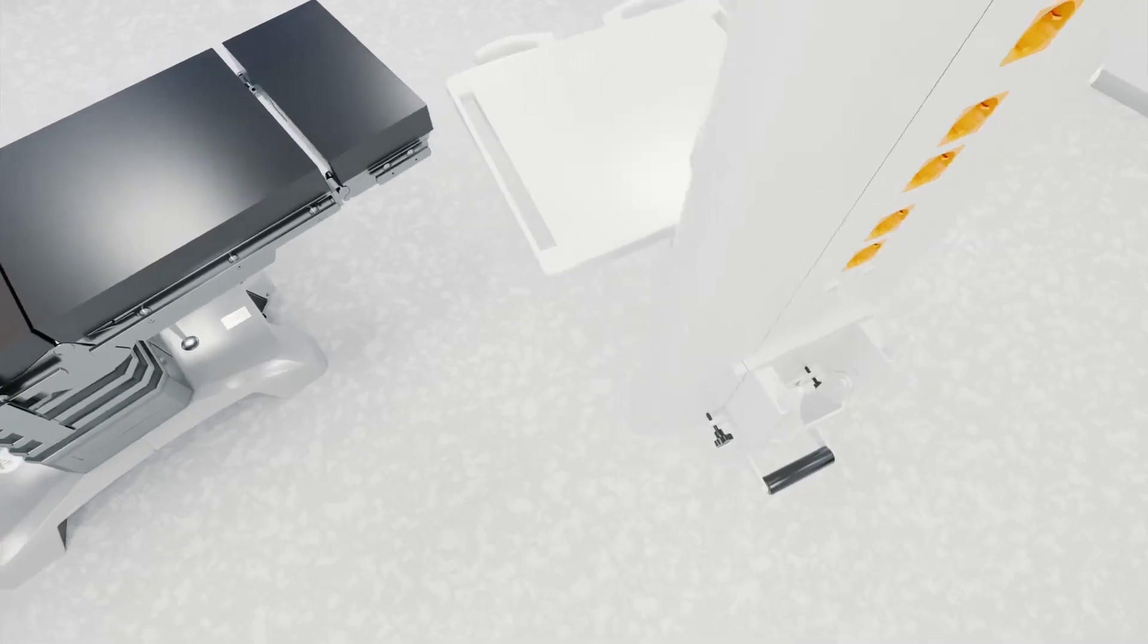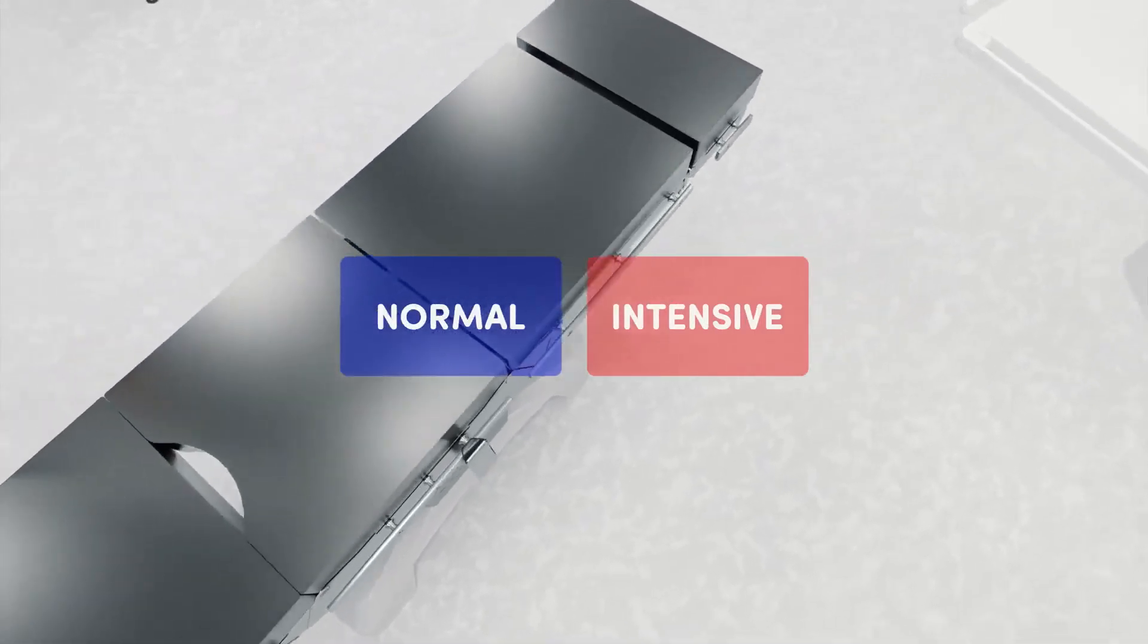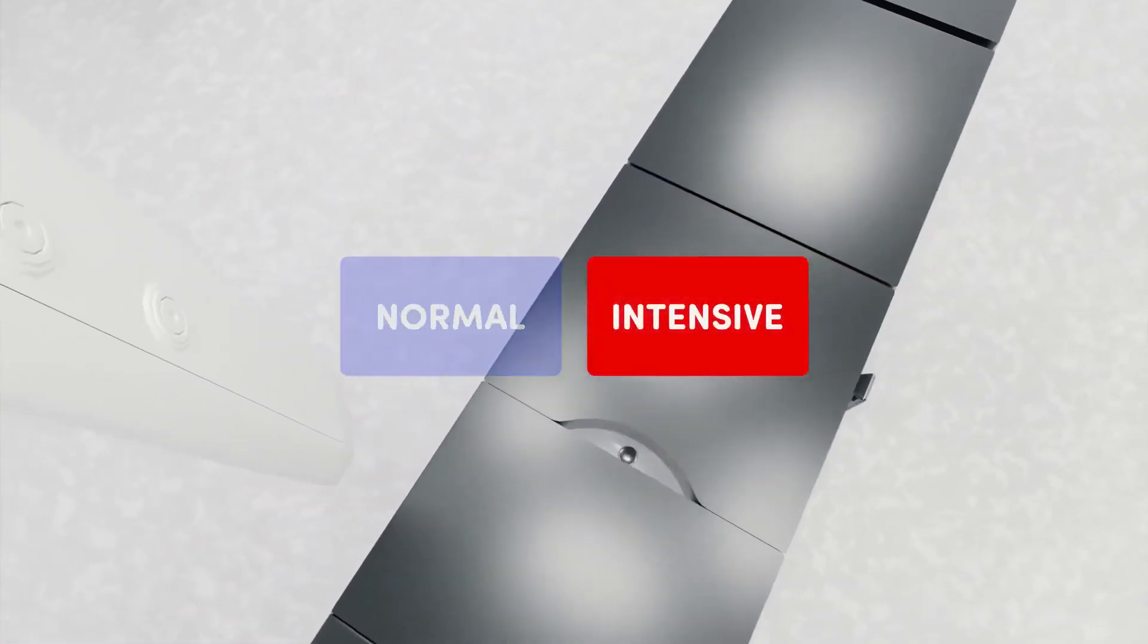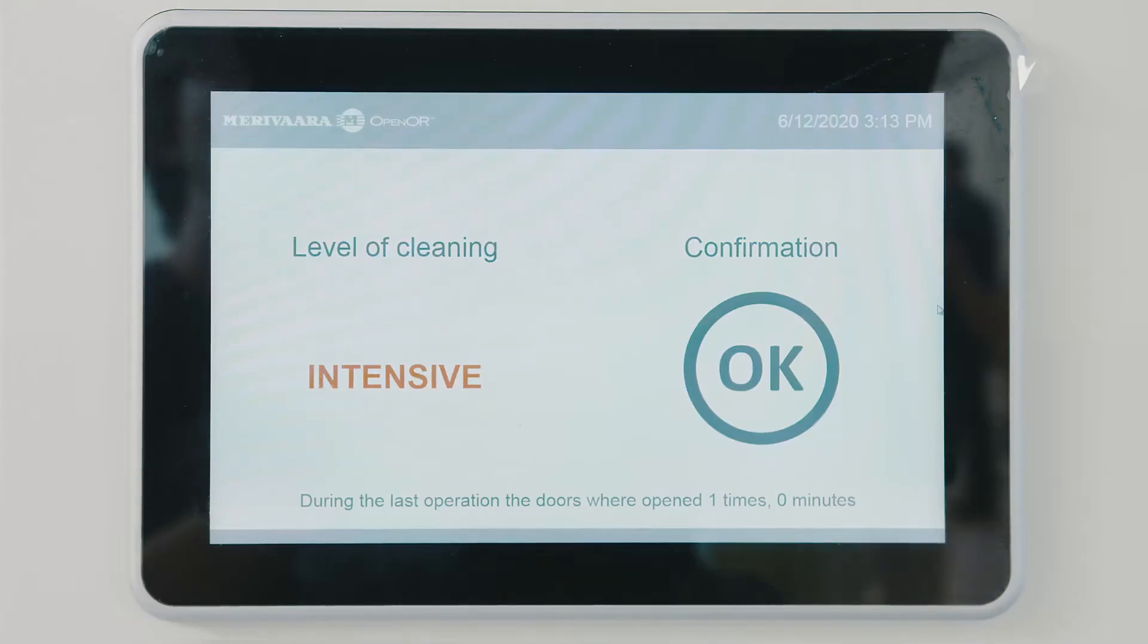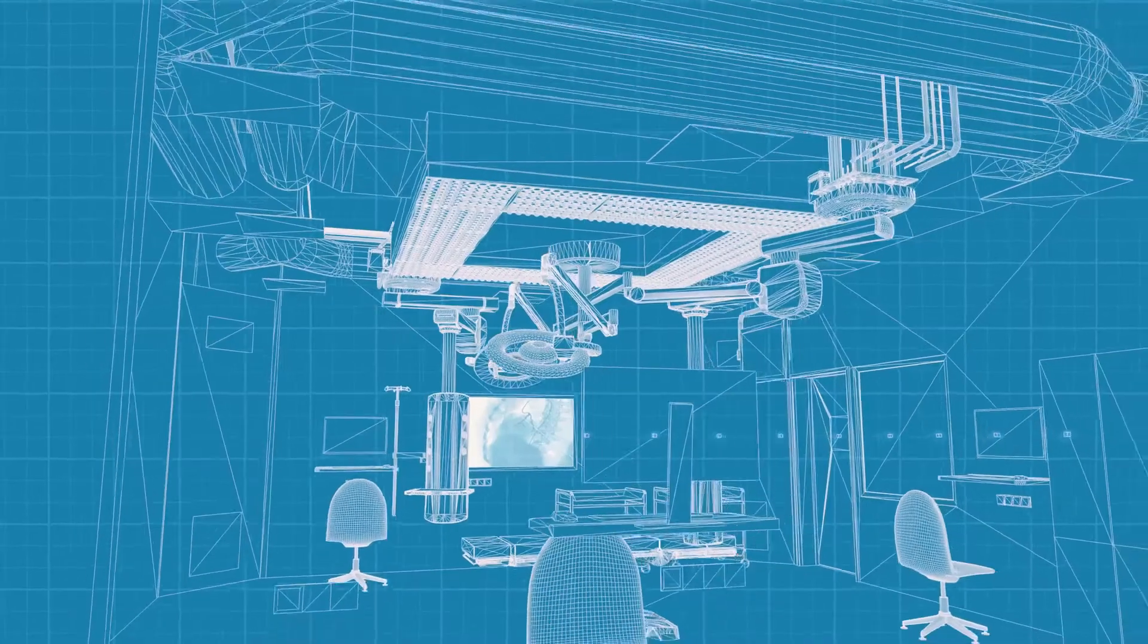The cleaning team can clearly see which rooms are ready to be cleaned and what level of disinfection is required. Once done, they click the info screen and the system goes back to normal mode.